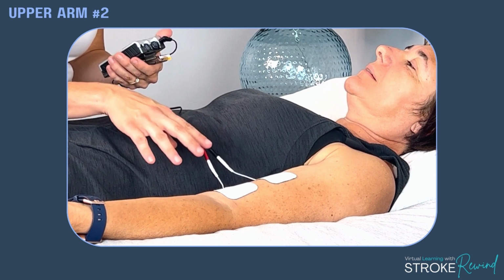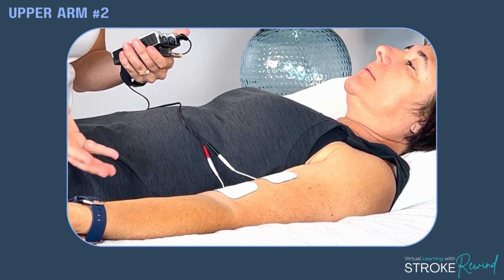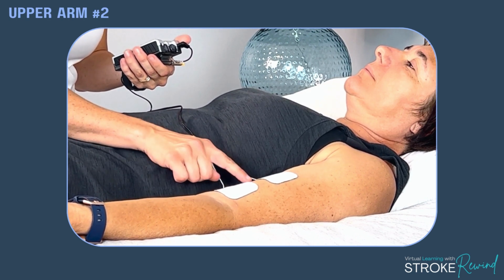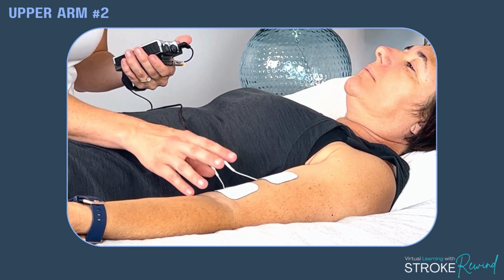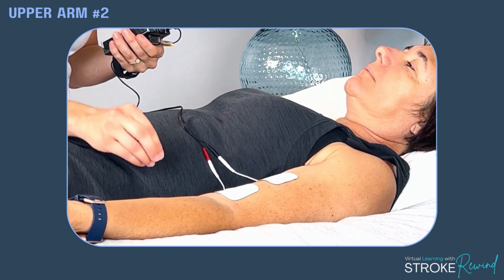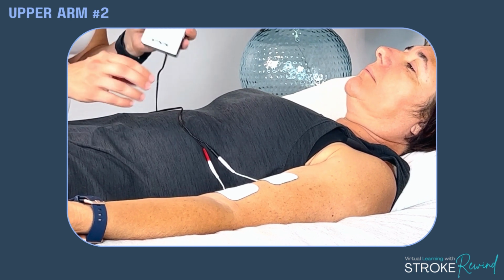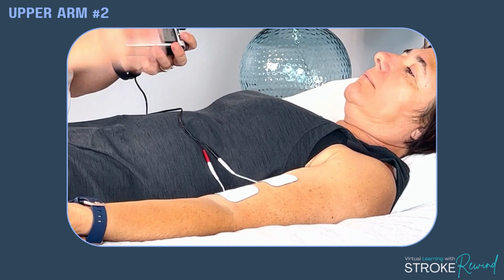Again, you can do this session about 10 to 15 minutes per session. Do this 2 to 3 times a day, really as many times as you want. And again, all this is doing is it's reminding her brain and saying, hey brain, my bicep's moving, my bicep's moving. This is what it feels like to move my bicep. For an individual who has no movement in their arm, it is an incredible tool, electrical stimulation, to remind that brain how it's supposed to be firing to move that hand again.